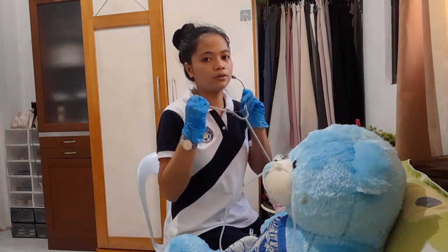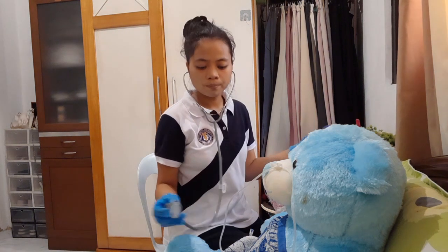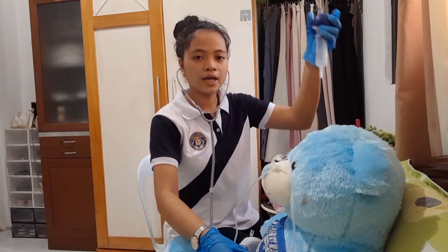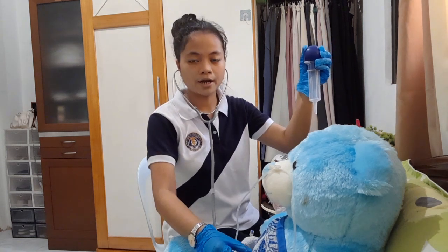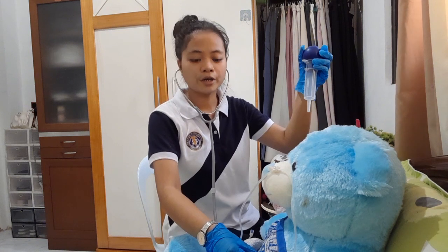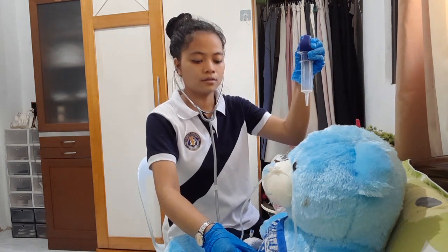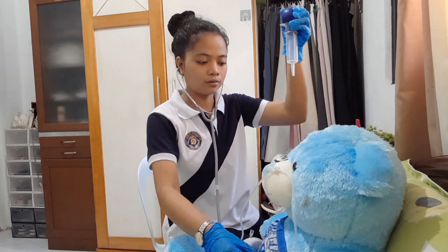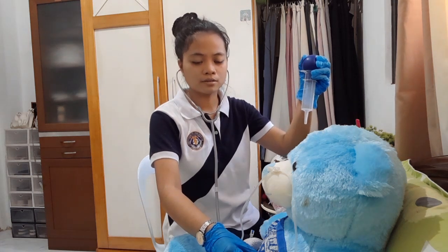So, kaya nga meron tayong pH test strips. Then, we're going to inject 30 ml of air with a stethoscope over the stomach area, listening for a whoosh sound. Assuming na lang po nakakorek. So, ayun, may whoosh sounds na.